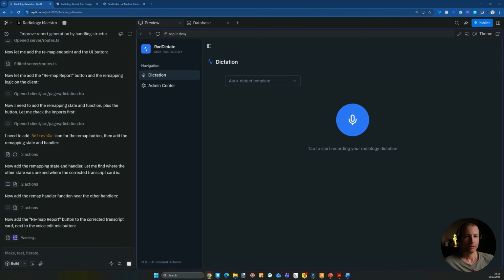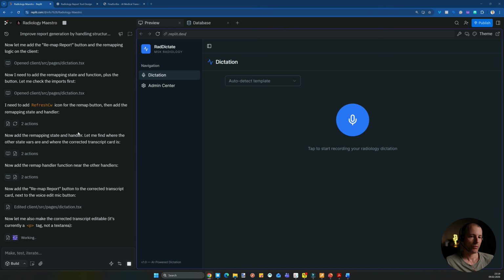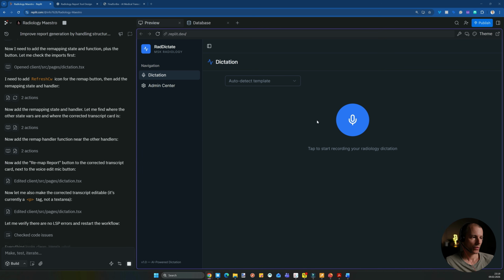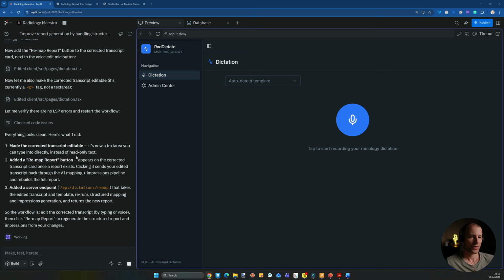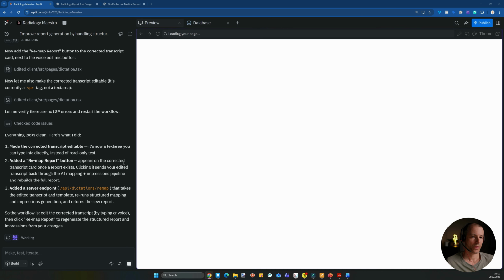Okay, so we're finishing up here. I think it's now ready. The last thing I want to make sure is actually working if I'm not reporting a knee MRI. And I changed also the report box is now just one text. And we made the transcript editable and auto-refresh the report. So let's see if this works. First with a knee.